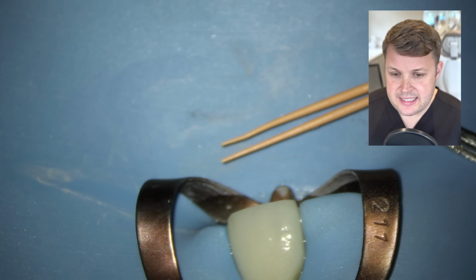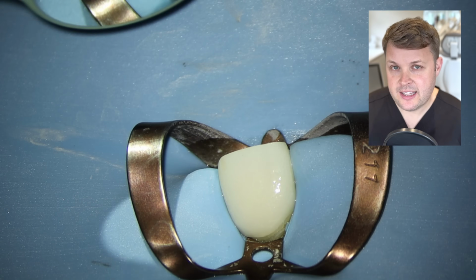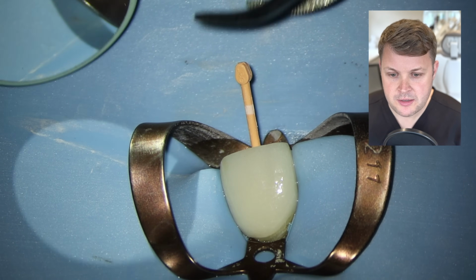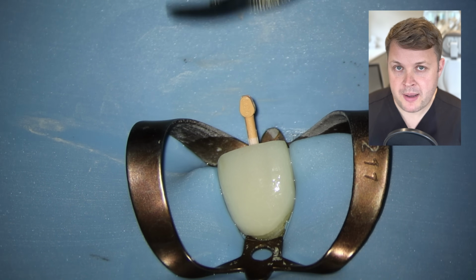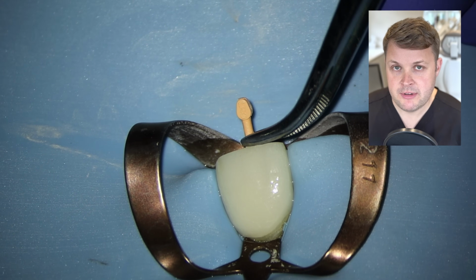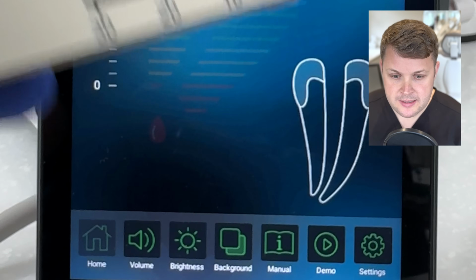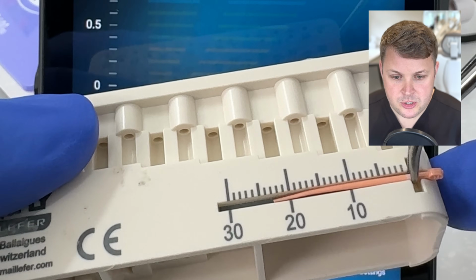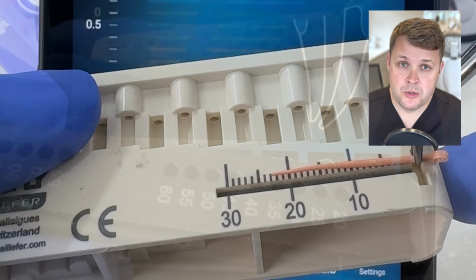So I'm going to use a higher diameter file here. I'm going to use a WaveOne Gold 45, and you can see here that it's just a little bit thicker than the 35. We push it to length, and again I notice that it does push past the zero reading on the apex locator, but not as much. So we pull it out, we measure it, and it's working about at 23 millimeters. So we're not too far off. So we don't need to go up another GP cone.